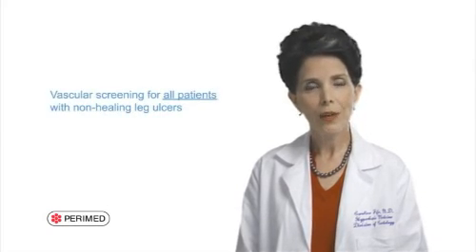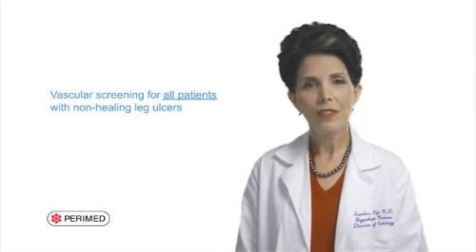Current evidence-based guidelines by every major professional organization emphasize the importance of vascular screening for all patients with non-healing leg ulcers. As a clinician, if you develop a protocolized approach for performing transcutaneous oximetry on all your leg ulcer patients, your confidence in this technology will increase and your patient outcomes will improve.